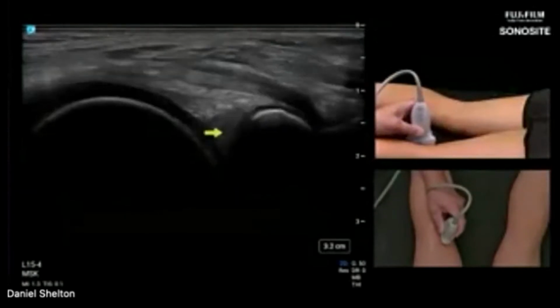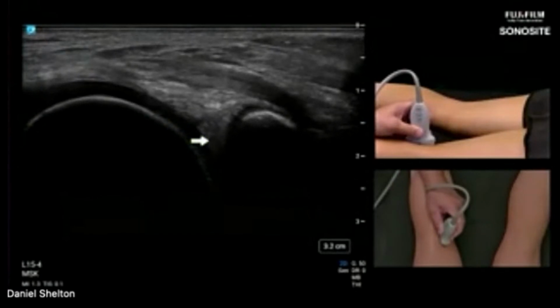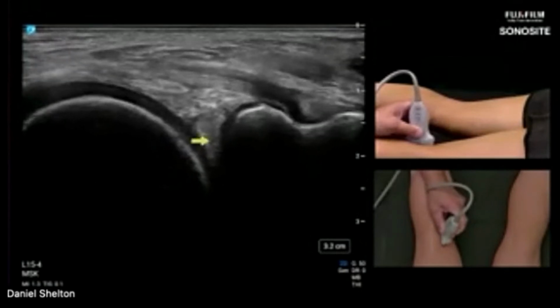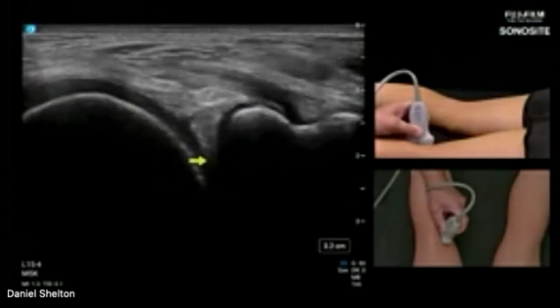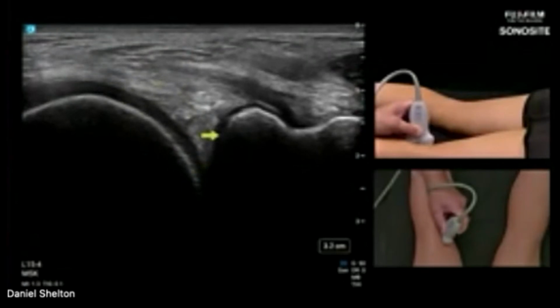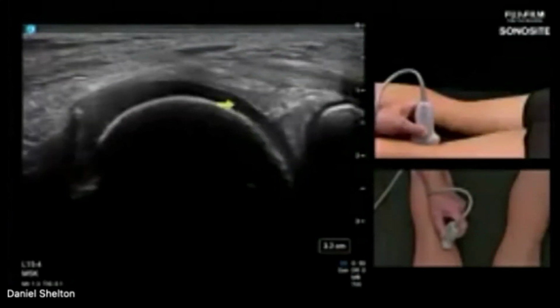This is a very clean look at the posterior medial meniscus here. In fact, I'm just going to drop my frequency a little bit to gen mode. There we go. And you'll see that acts much like a flashlight on the Sonosite PX. So here's that posterior medial meniscus. Just for your reference, it's not the topic of today's discussion necessarily. So we're going to keep chasing the bony landmarks until we're very familiar with where we are. Here's the posterior tibia. Now let's go look for the tendon that sat on top of the medial femoral condyle.